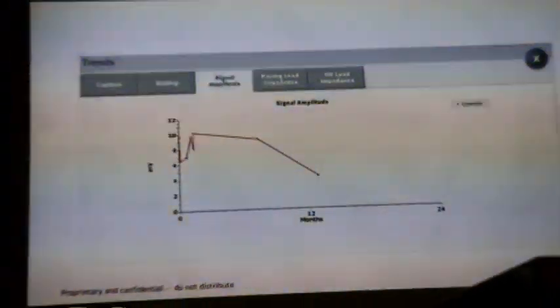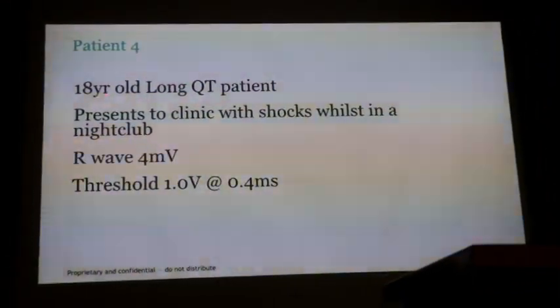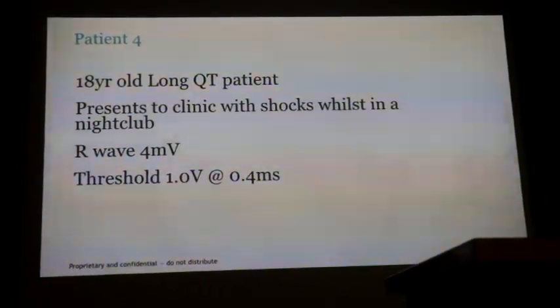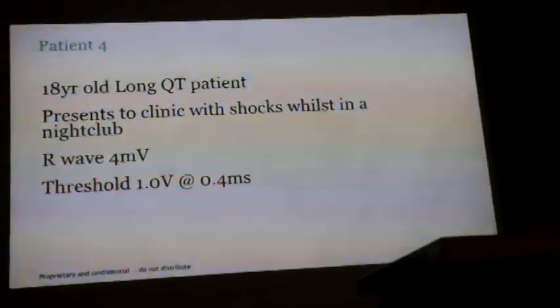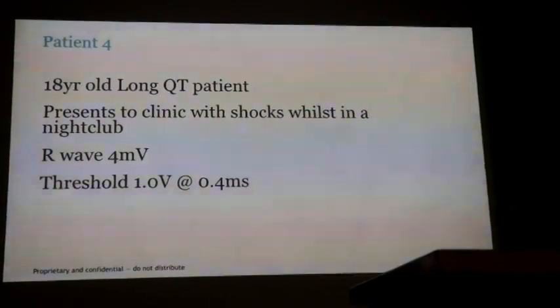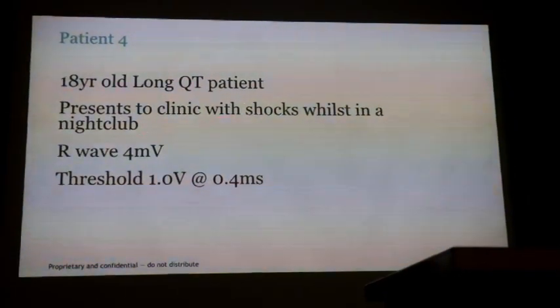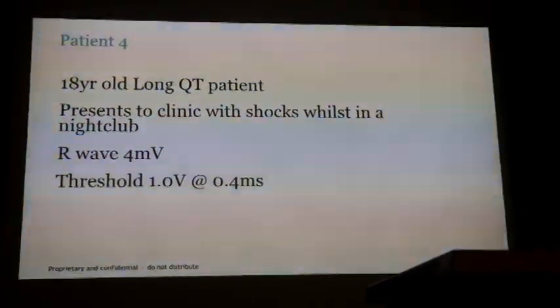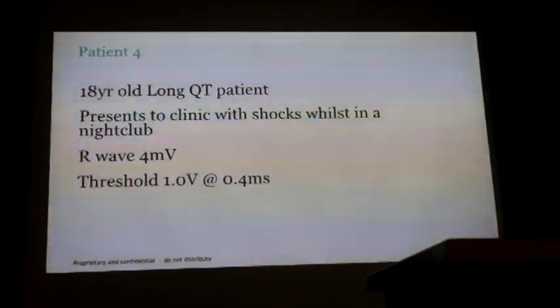Okay, here's the next patient. He's 18 years old, he lives in Dublin, a nice little Irish fella. He's got long QT syndrome, picked up on screening, so a family member was found to have long QT, arrested, they put a device in, we put a device in. He presented to clinic with shocks while he was in a nightclub in Dublin. So he's out late Saturday night, in the club, enjoying himself, and then his device started shocking him, okay?